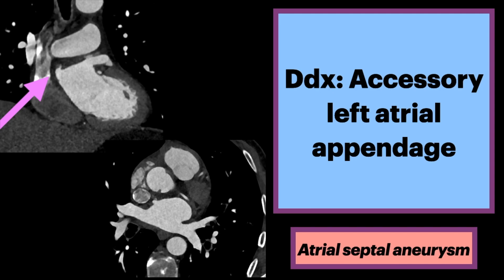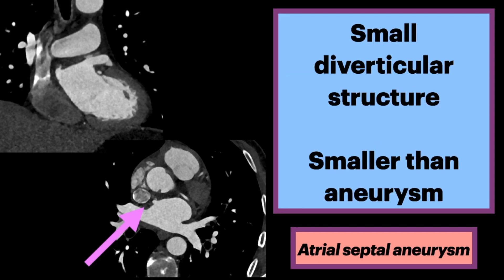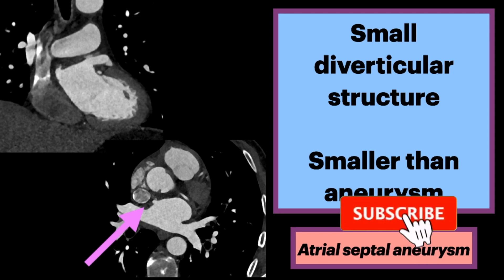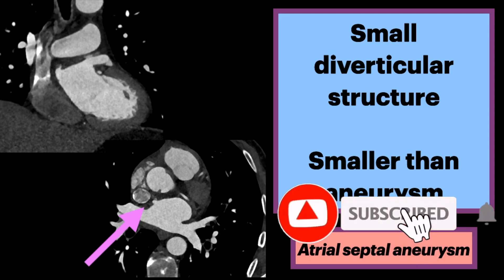It's important to distinguish from an accessory left atrial appendage. Here we see a 4mm triangular-shaped outpouching from the supermedial wall of the left atrium, which has a wide base and smooth margins, consistent with a left atrial accessory appendage. This is found in less than 10% of patients. They are seen as a small diverticular structure projecting from the right upper side of the left atrial wall. It's important not to confuse this with an atrial septal aneurysm, which is usually larger.